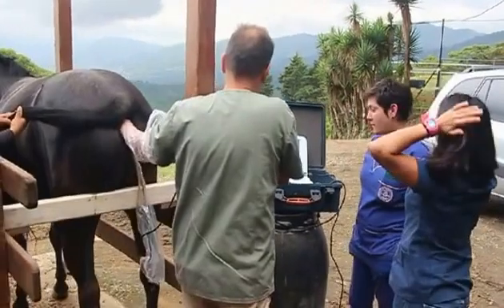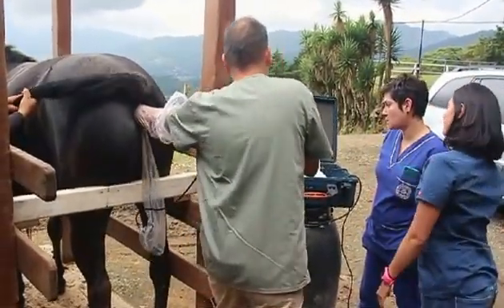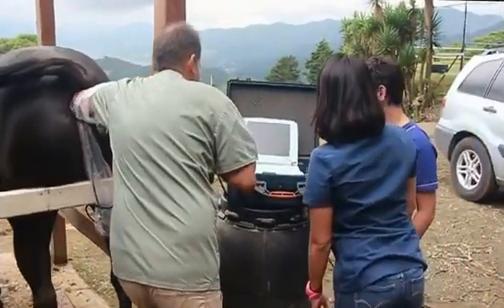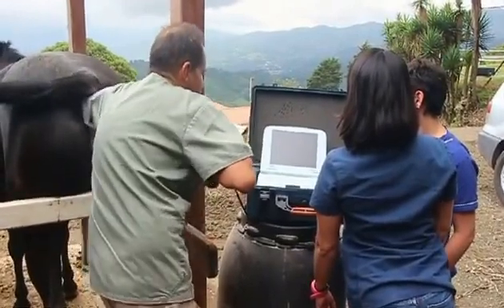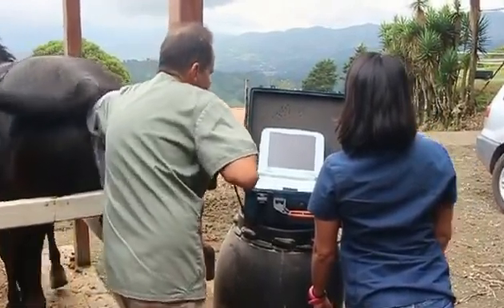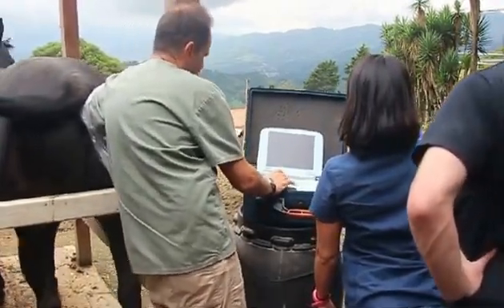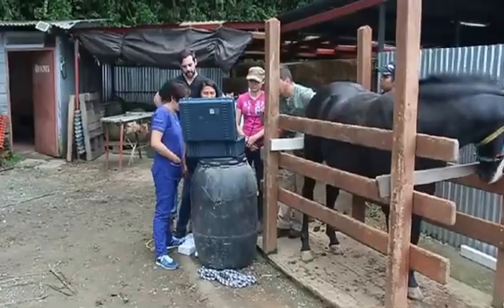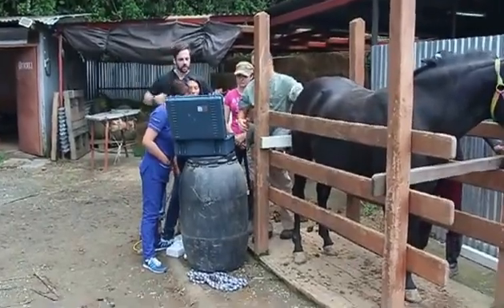At this stage the foal is the size of a small dog, and it is very easy if you are a veterinarian to identify the parts. Again, you have to take the probe and enter through the back, hold it up against the uterus, and then you can see the different horse parts. He's about to point to the screen and show the students, and here they all are again checking out the picture and verifying everything.